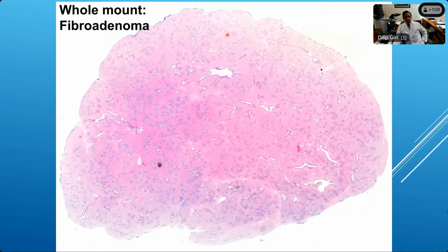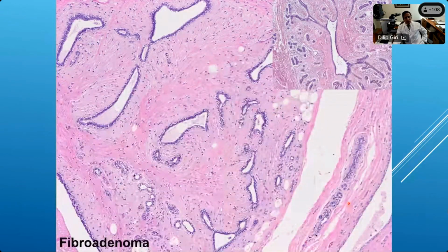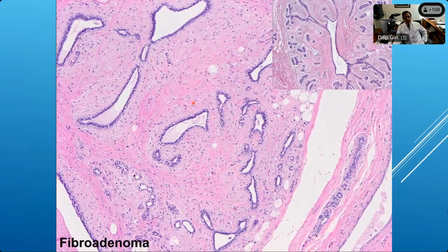So just to recapitulate, fibroadenomas are well circumscribed. There is nice, uniform distribution of the ductal element. There is no unequal distribution; it is symmetric everywhere, with equal spacing between the stroma and the ductal elements. That's what you want to see in a fibroadenoma. And also the stroma is very low grade, not doing much.